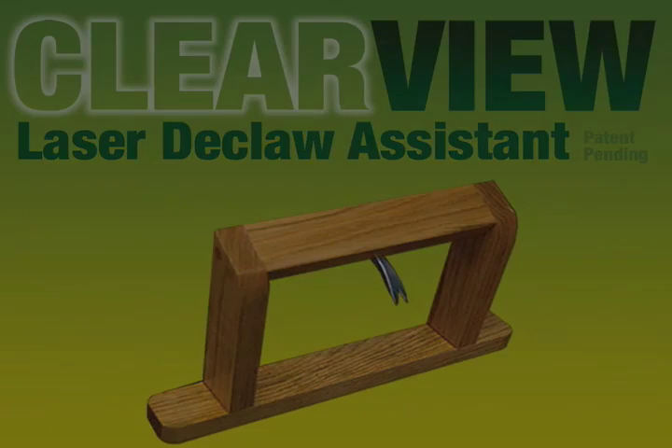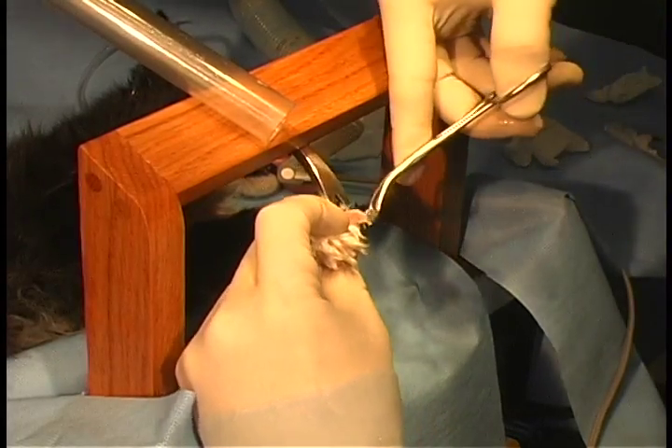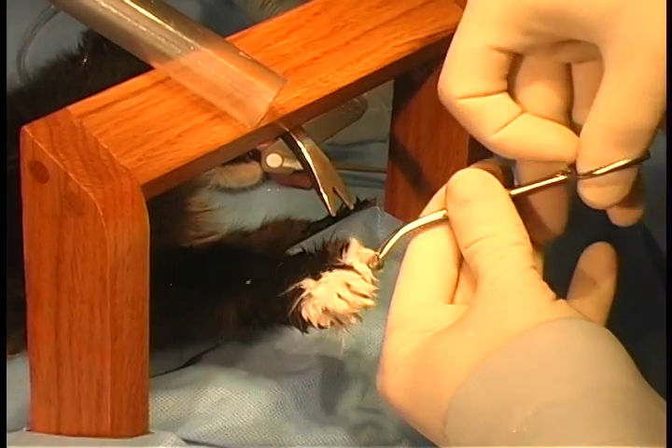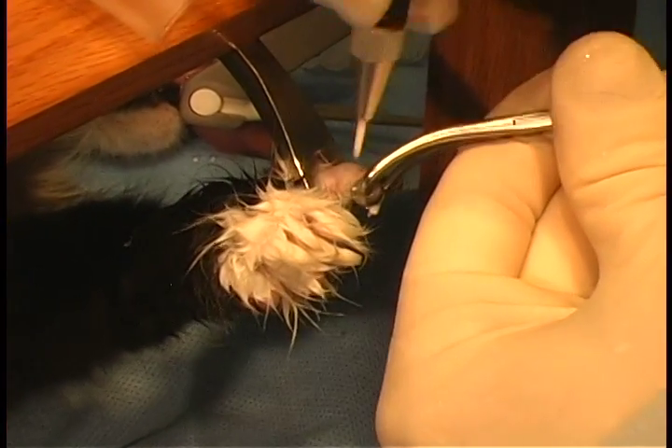We will now demonstrate its use. Thumbelina is a seven-month-old domestic long-haired feline. The need to shave the paws in long-haired cats is no longer necessary with the extra exposure provided by the ClearView Laser Declaw Assistant.